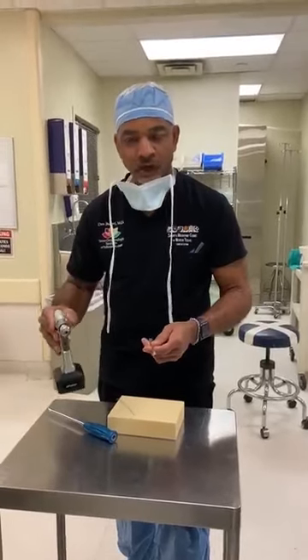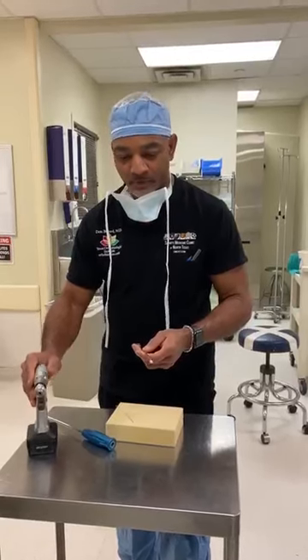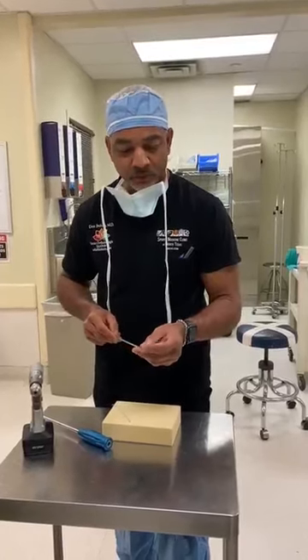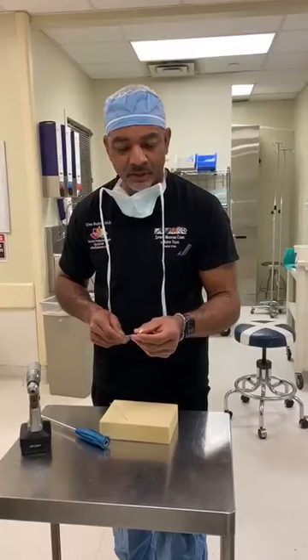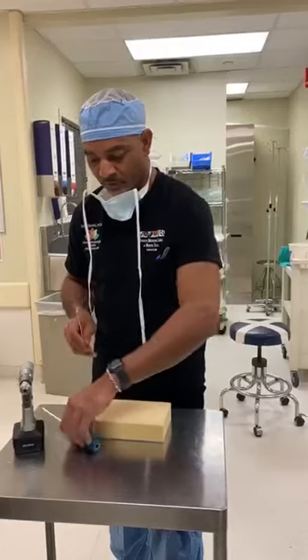This is an all-suture anchor designed for labral repair. This is a 2.1 millimeter anchor. It's got a flexible shaft. It comes single or double loaded. Here's the pull part. Here's the guide.